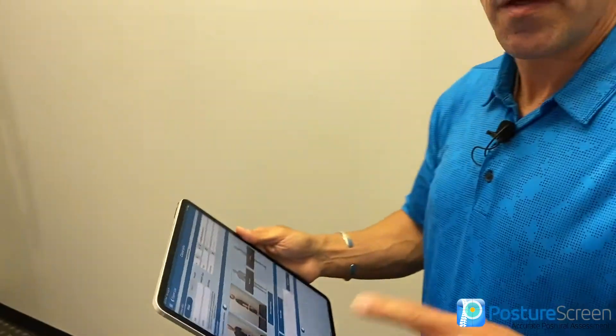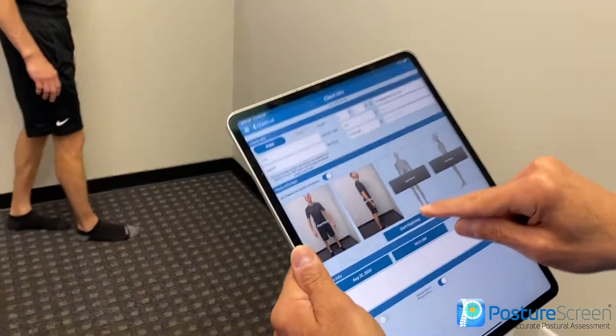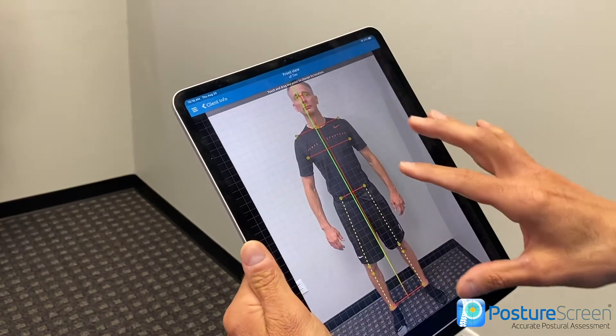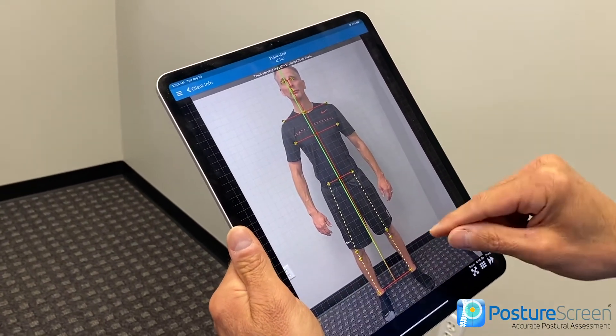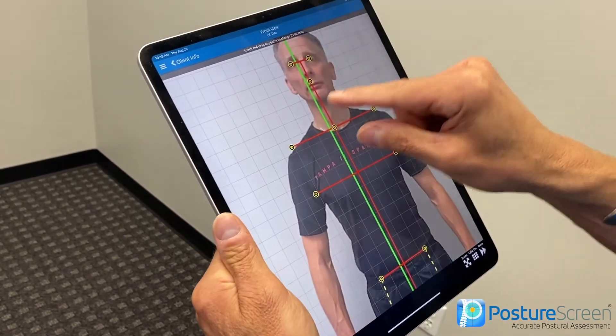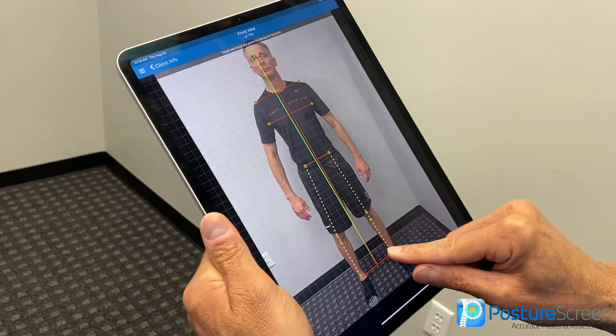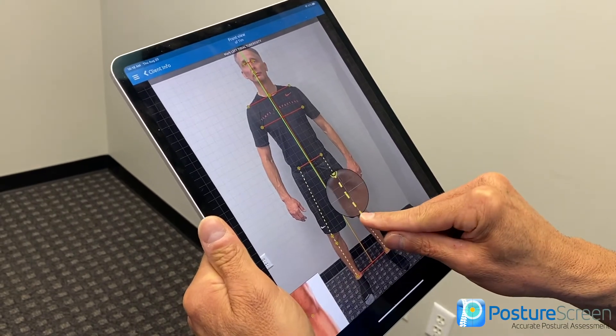I just want to make a comment about this: the computer is not foolproof. It is your responsibility as a professional or clinician to double check the points. While it's extremely good, you're going to have to correct and move the dots upon occasion, depending on lighting, movement, things like that. Think of it as your assistant. Let's see how the computer did — it did a fairly good job. It missed his knee a little bit, it missed his shoulder a little bit, so let's blow this up. I'm going to drag this down and move this over just a little bit.